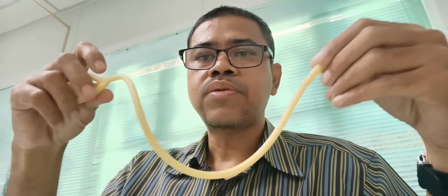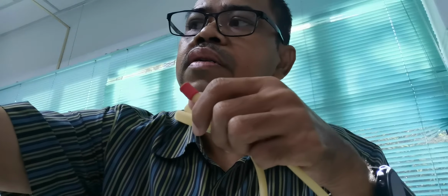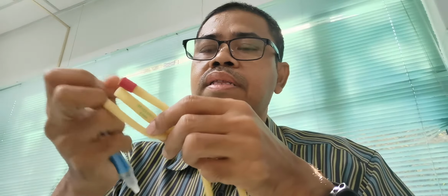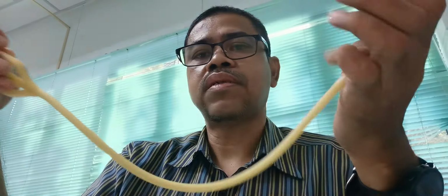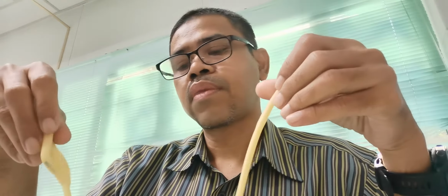Okay, so first of all, before you insert, you have to test the balloon by inflating water for injection into these lumens, and it's written there how much you can insert. Some say 10 cc, while a bigger catheter, 24 for example, can be inflated until 30 cc.